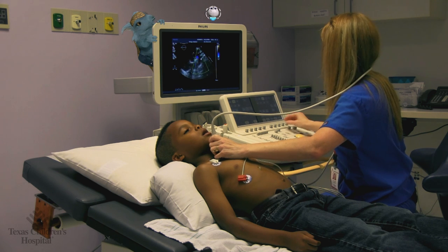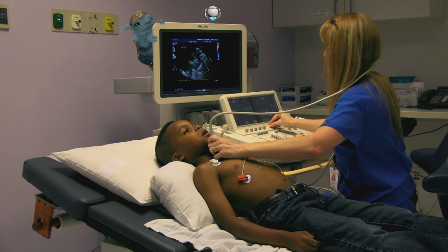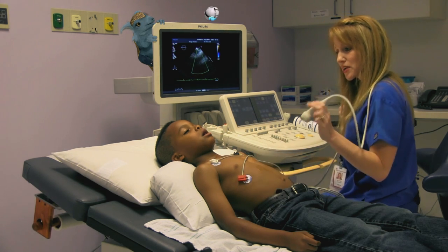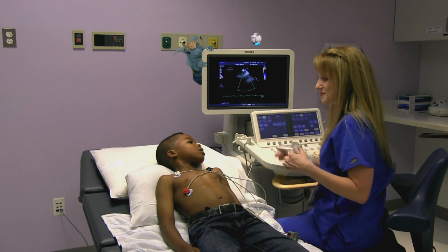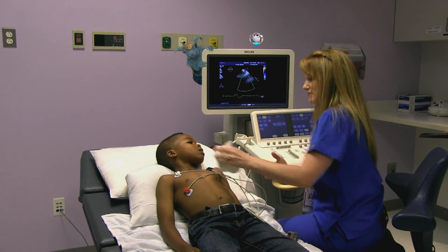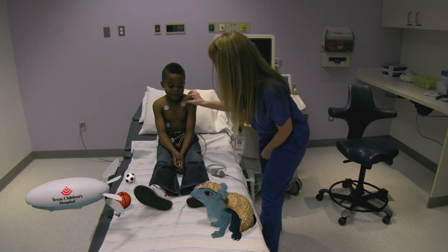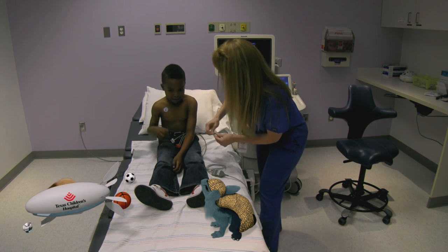These machines are so clever. That's the top of your heart. Now we're going to wipe the jelly off. There you go. You did so well. Let's go.